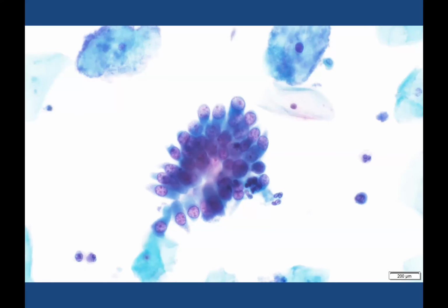This was a different case, and again you can see why somebody might have been concerned by these endocervical groups, because they do have a somewhat three-dimensional quality to them. But when you look at them, first of all, the nuclei are all nicely orientated, okay? And they're orientated towards the basal third of the cell. I talked earlier about these little tags of cytoplasm. Here we are, a little tag of cytoplasm where the cell has literally been pulled away from the basement membrane. You can see that the chromatin across all of them is the same. The nuclear membranes are nice and smooth and round. We've got a little bit of inflammation here. I wouldn't be worried by this.